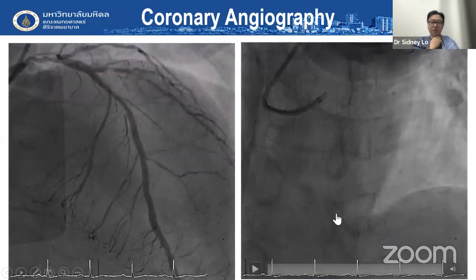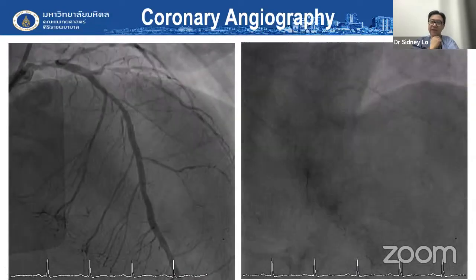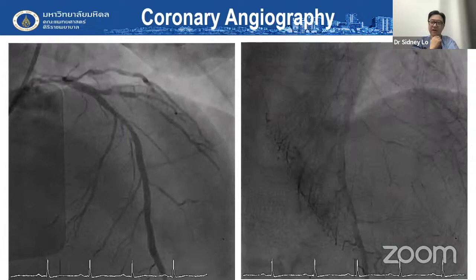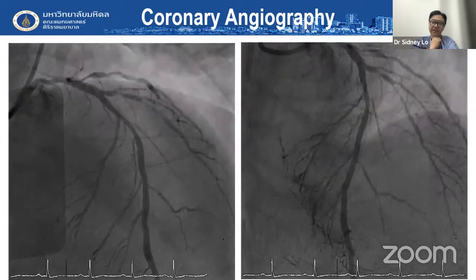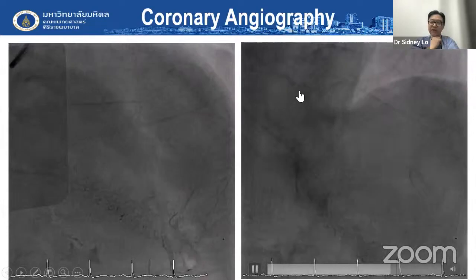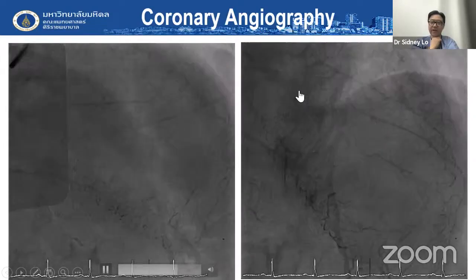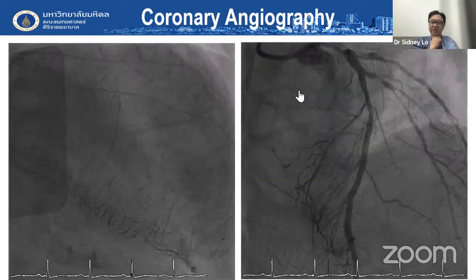Now, we think that during the case, we would check the patient's hemodynamics a little bit. So essentially, we would do a routine right heart catheterization, check the PA saturation, and we'll see how compromised he is. Now he's actually improving. So his EF has gone from 20 to 38% or so just on medical therapy. And presumably most things are viable and the EF will improve.